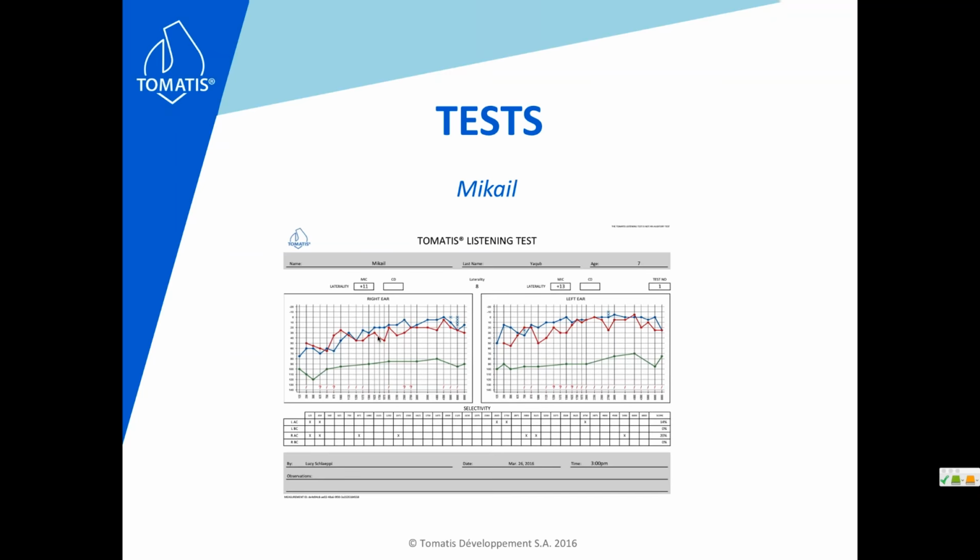There's potential. In terms of the bone and the air conduction, it's all messed up, I think, in all areas. There are some big gaps. It starts off low in the body zone, particularly on the right ear. I think the biggest distortions are in the body and in the communication zone for both. Plus, the bone curve is trying to overtake, and there's a lot of stress.